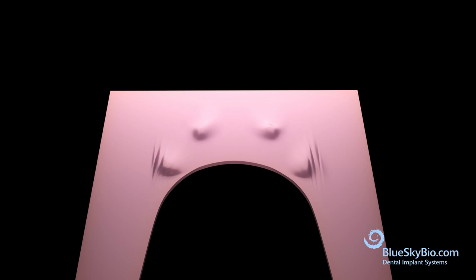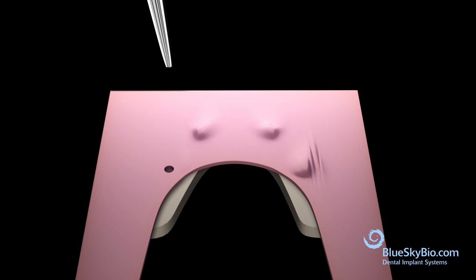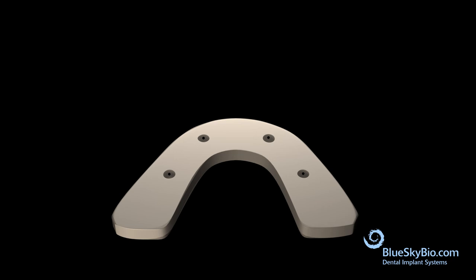Place a Trilor arch bar under the wax and mark the holes. Use a lab handpiece and cut holes into the Trilor arch bar. Place the Trilor arch bar over the cylinders.